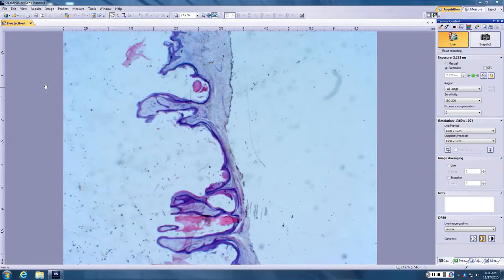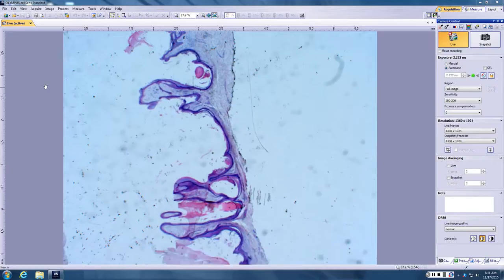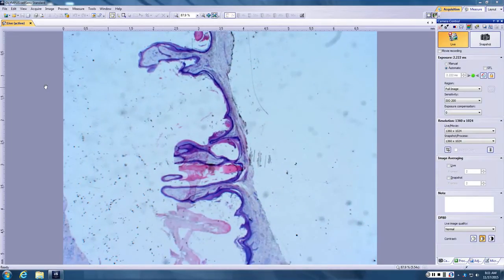Sounds like you're describing what kind of thing? I'm sure you're going to have some name that's like a combination of like, it's an invaginated keratoma. Classic. No, actually, but I appreciate it. I don't think it's an IFK, which means like a cup-shaped, semi-keratotic thing. No, IFKs are more like a finger that protrudes downwards. So, anyone want to jump in?